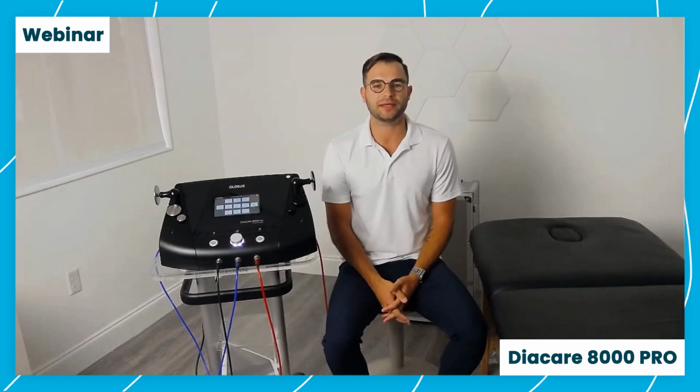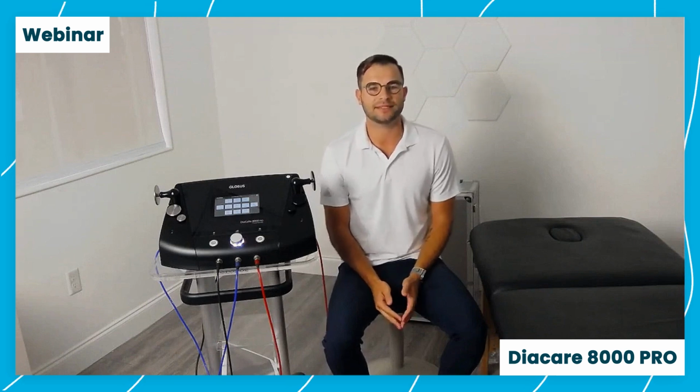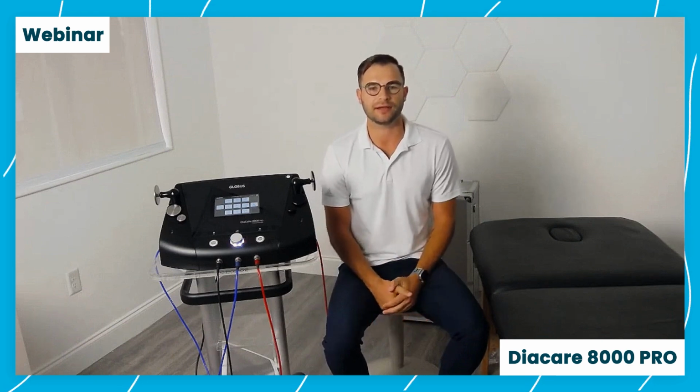So to begin, what is Diacare therapy? Diacare therapy improves microcirculation, thereby promoting healing, maintaining balance, and improving performance of that muscle or structure. Diacare applies high-frequency electrical currents to generate endogenous heat within the body. Therefore, we're trying to get that patient to be able to move, feel better, promote healing and circulation throughout most of the tissues of your body.